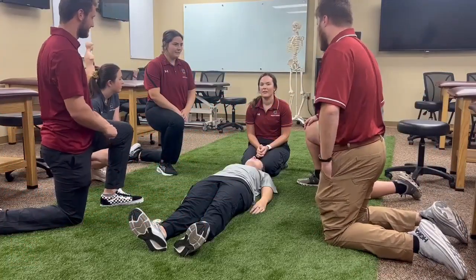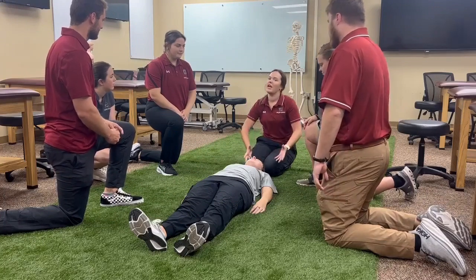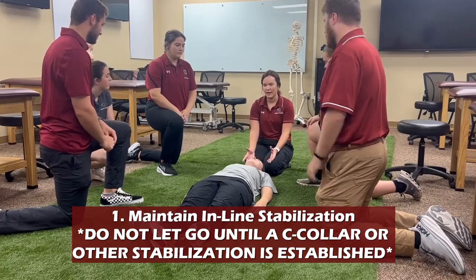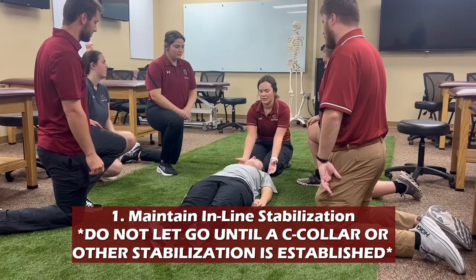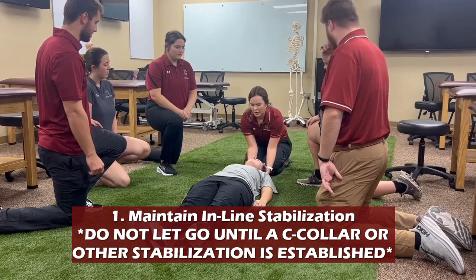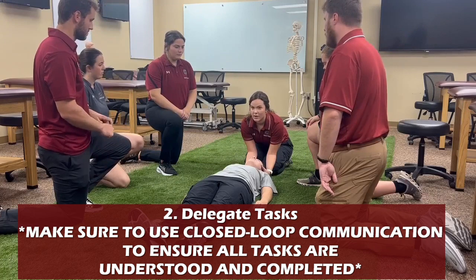Okay, so we've determined that our patient has a C-spine injury. So the first thing we're going to do is the head clinician is going to maintain inline stabilization of the C-spine. You can do this either with the trap hold or scooping around the ears. We're going to avoid the trap hold in this situation because when the scoop stretcher comes in, it might be hard to move your arms. So we're going to maintain C-spine, and then I'm going to direct each of these people to do something.